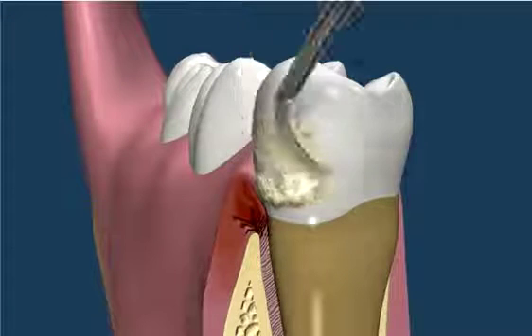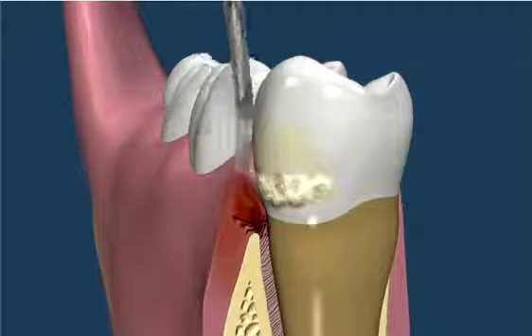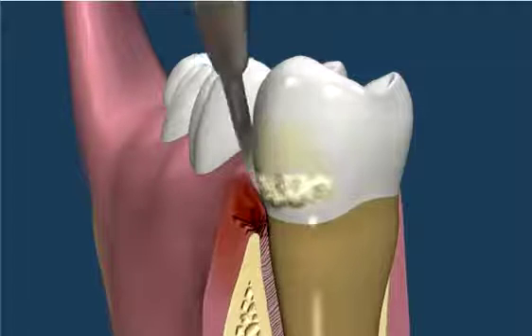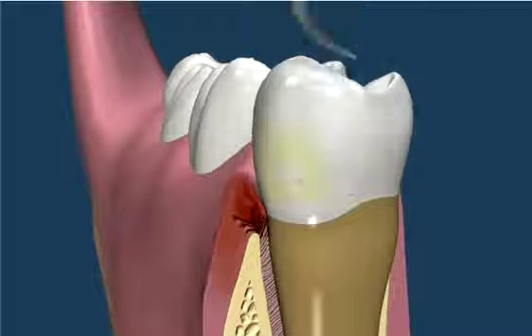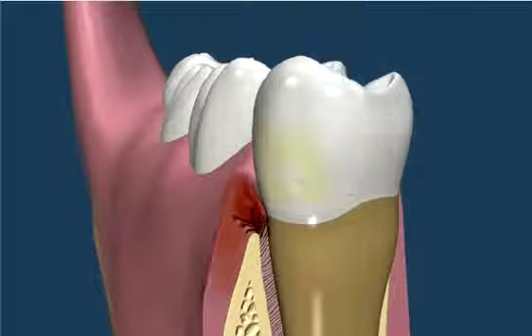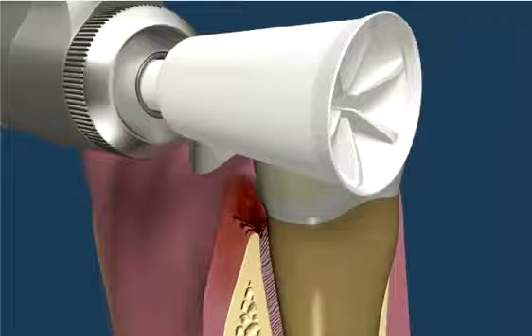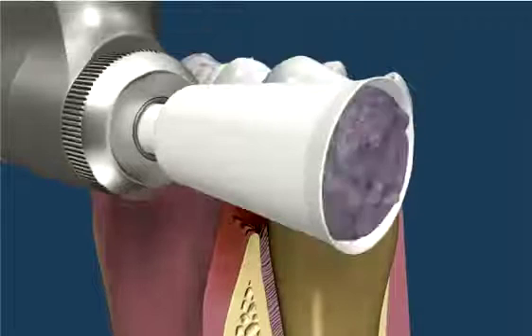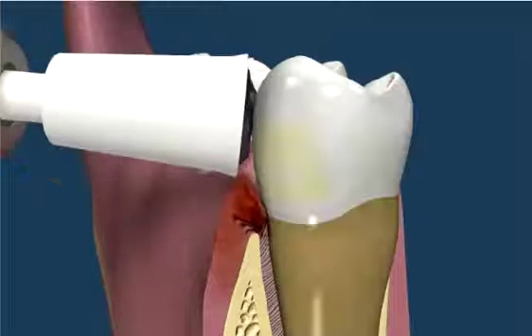The hygienist or dentist will remove the tartar with various scaling instruments and then polish the area with a polishing cup and polishing paste.